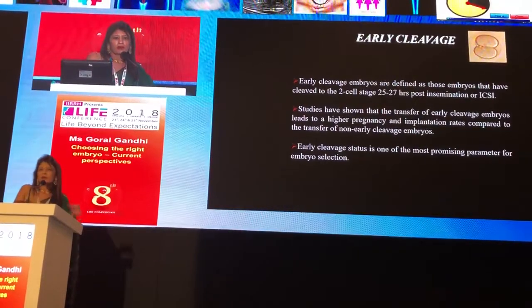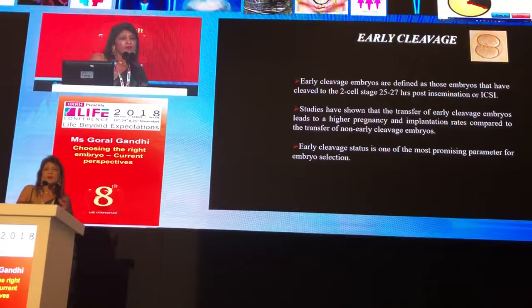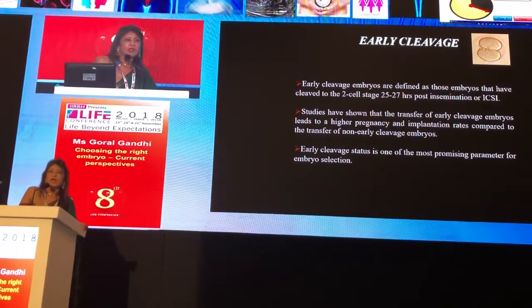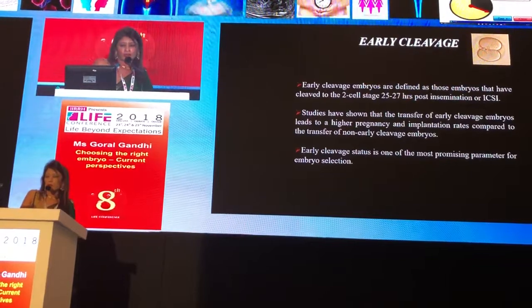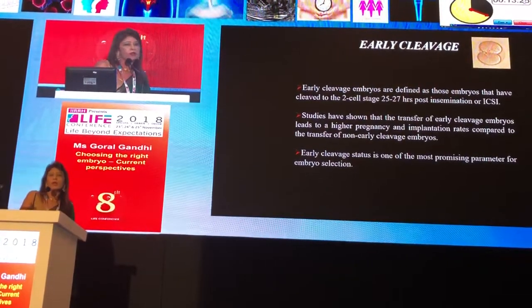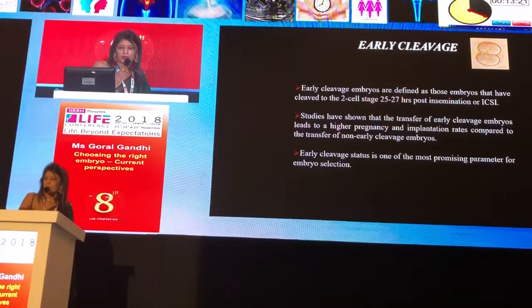I think all of us will agree, and in my experience also I've noticed over the years, that whenever you see an early cleaving embryo, it is a very promising parameter, and these are the patients that generally always get pregnant. So early cleavage is one thing that you must always look for, and if you see an early cleaving embryo, then that embryo should be selected for transfer.